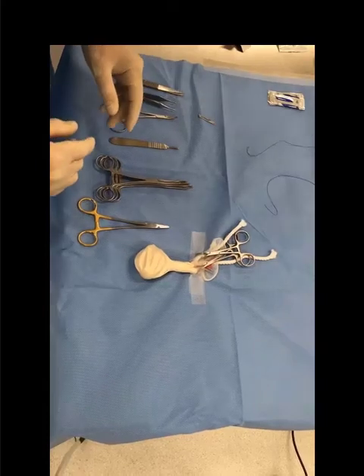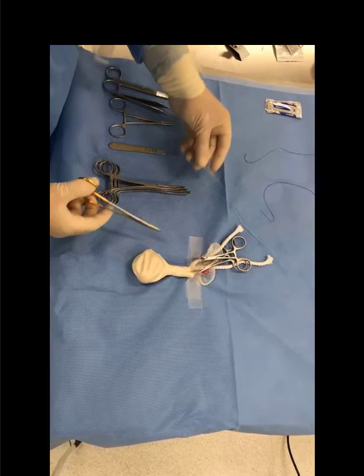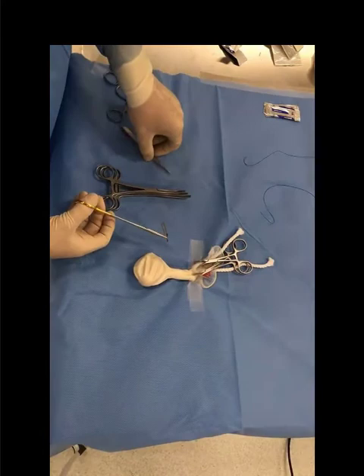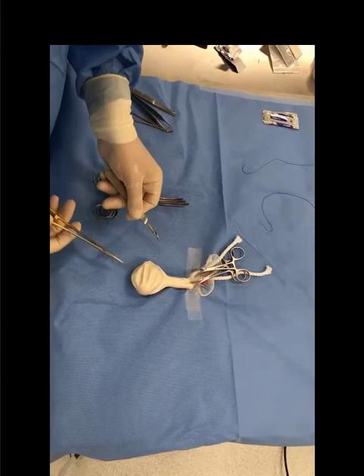This video is going to demonstrate using the canine castration model. We have the ability to do both an open castration and a closed castration. First we're going to load up the scalpel blade — we're going to use a number 15 scalpel blade. Always work on the blunt side of the blade. Hold it, one click, then place the scalpel handle pointing downwards and away, slide on parallel, and bring it forward until we hear the click.